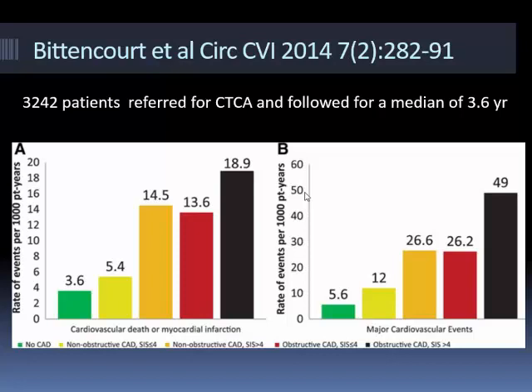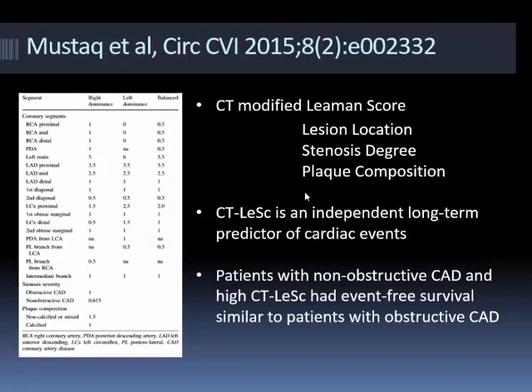One of the things you need to get across in your report is emphasizing that you may say no significant stenosis, but to your referrer that may mean that they don't have significant coronary artery disease. So you want to emphasize whether somebody has a high atherosclerotic burden or not. That's where calcium score can be useful, because it gives you an objective measure. Everybody in medicine loves a number, don't they? When you say EF of 45%, it's got to be 45%, it can't be 41. People forget that there is variability. But the point is, people love numbers in medicine. So if you can put a number to the degree of atherosclerosis, then that's very, very helpful.